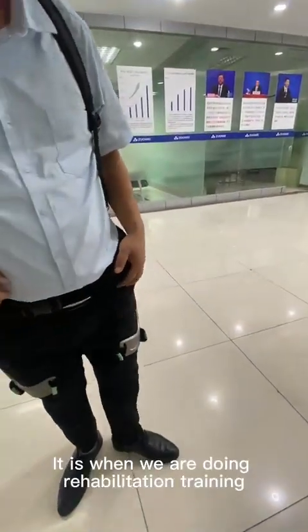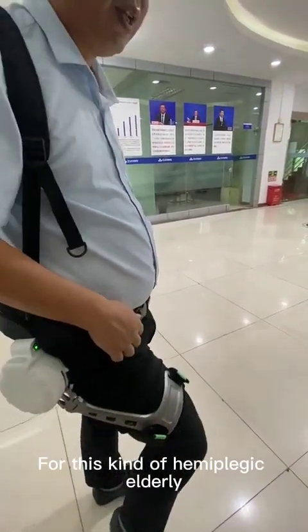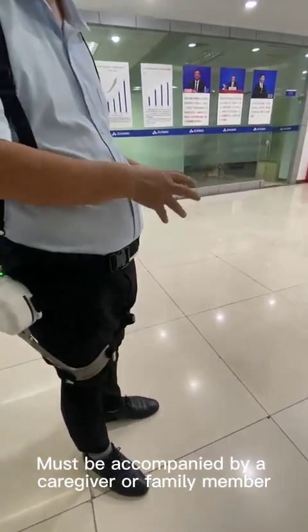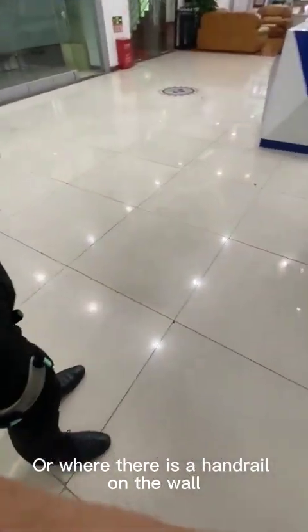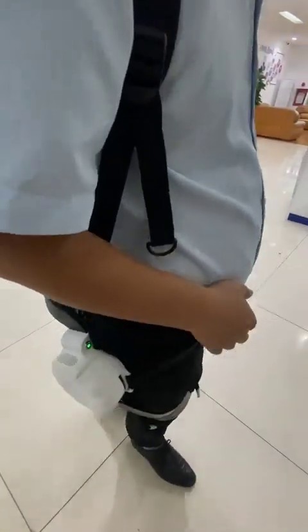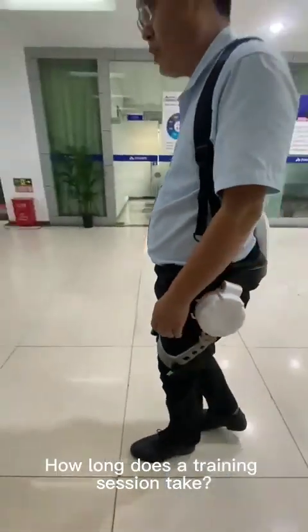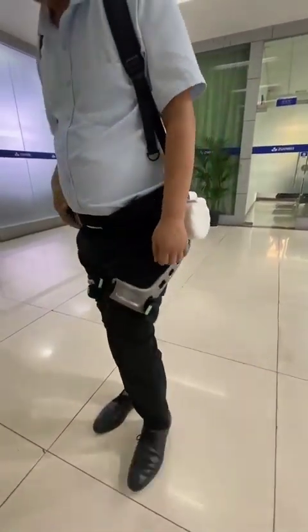The third requirement: when doing rehabilitation training for hemiplegic elderly or elderly with weak legs, there must be a caregiver or family member accompanying, or the person must be near a handrail on the wall. It is not possible for this kind of person to use the device alone. A training session is generally recommended to be 20 to 30 minutes, and must not exceed 30 minutes.